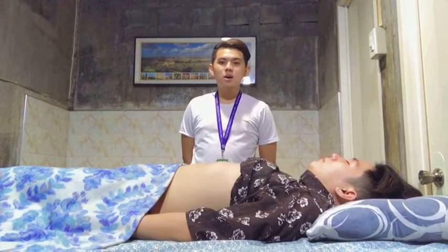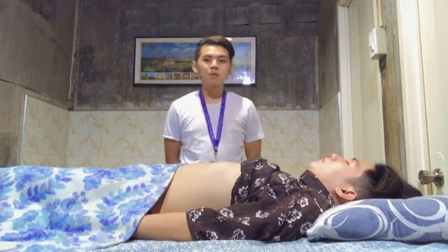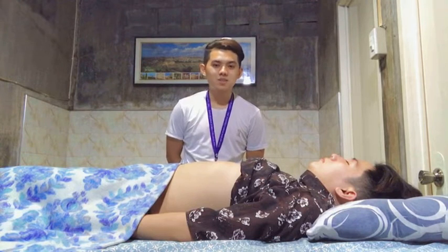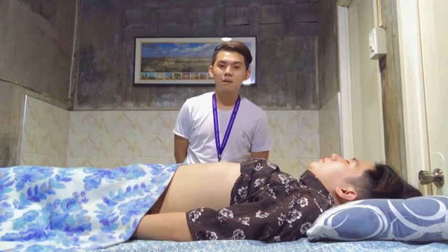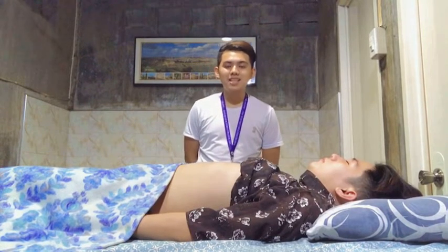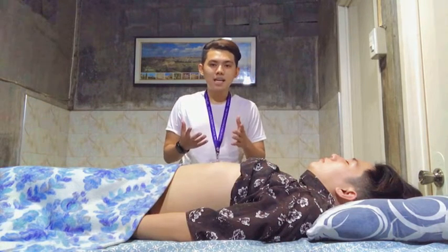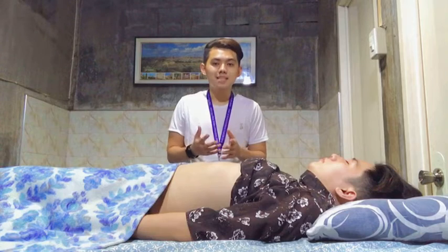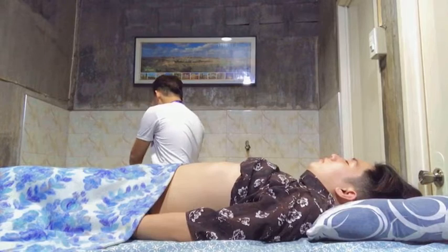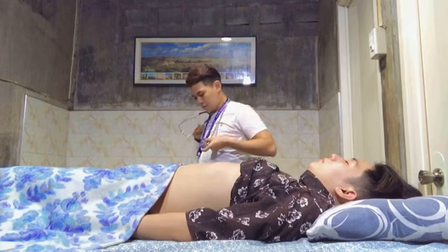After inspection, we will be proceeding to auscultation. So first, we will be auscultating for bowel sounds. Auscultation comes after inspection and before palpation because palpating prior to auscultation might distort the quality of bowel sounds. So of course now, use the diaphragm of the stethoscope and make sure that it is warm before placing it on the abdomen. Warming both our hands and the diaphragm before application will be helpful for the assessment, particularly in ticklish patients. So of course first, we will be sanitizing our stethoscope.